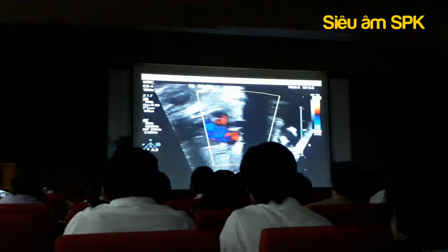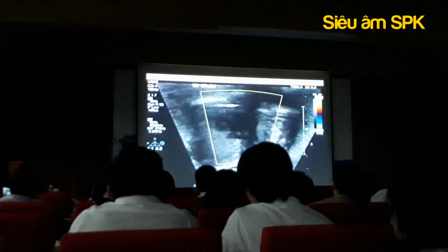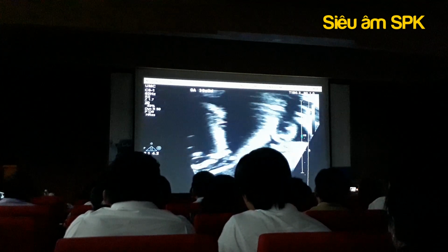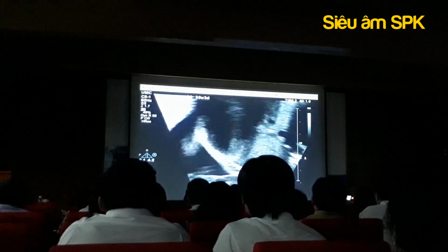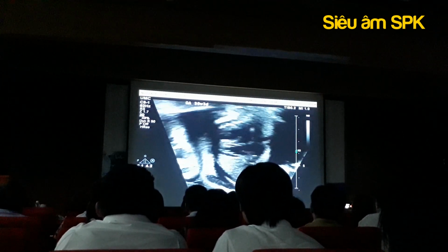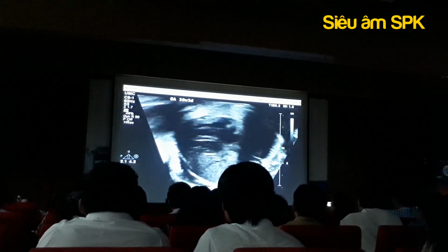I'm going to keep in mind that we haven't seen the right pulmonary artery yet and look at something else while I'm waiting for this baby to roll over. Như vậy là chúng ta chưa tìm thấy được cái động mạch phổi phải. Chúng ta phải nhớ là chúng ta đi tìm. Giờ trong khi chờ cái bé nó quay lại chúng ta sẽ khảo sát những cái khác.